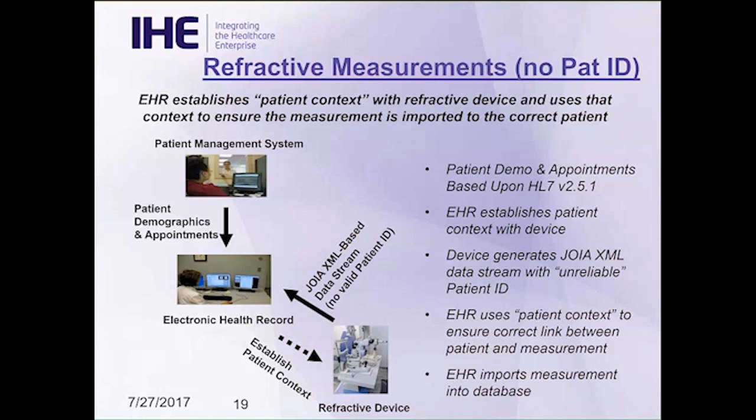But the main difference now is we standardize the XML data stream, so we're able to accomplish this the same way with all the different refractive devices. So if I have 2 lensometers, it's the same data stream. It's not a data stream from vendor 1, vendor 2 that's completely proprietary. It would be the same. And so we basically standardize that data stream that is connected to the EHR.